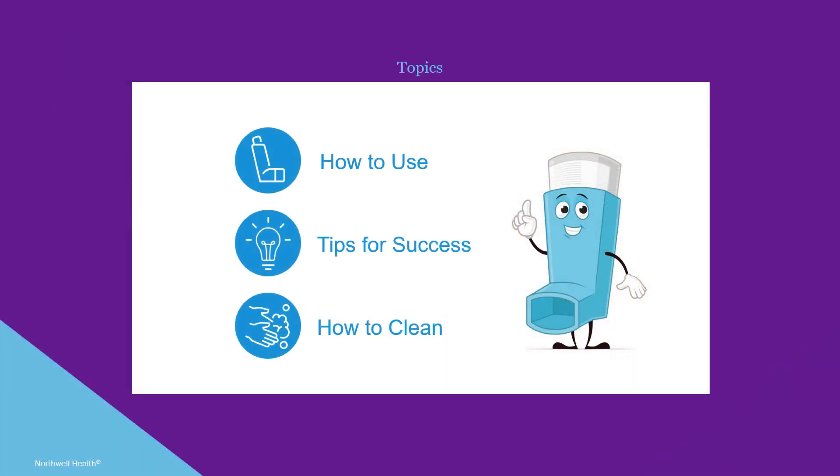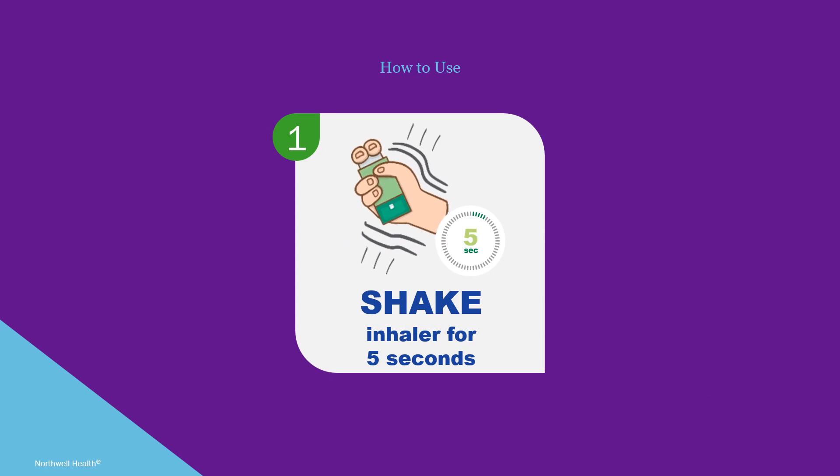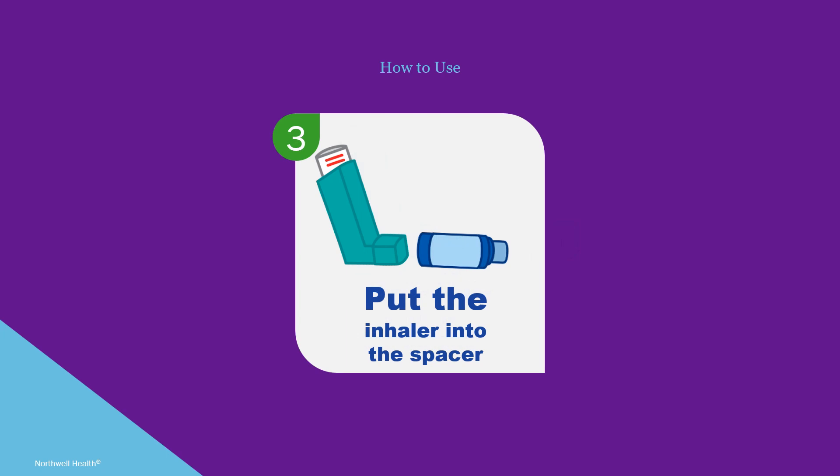Let's begin with how to use the inhaler. First, shake the inhaler up and down for five seconds. It helps to count 1001, 1002, up to 1005. Next, remove the cap off the bottom of the inhaler.